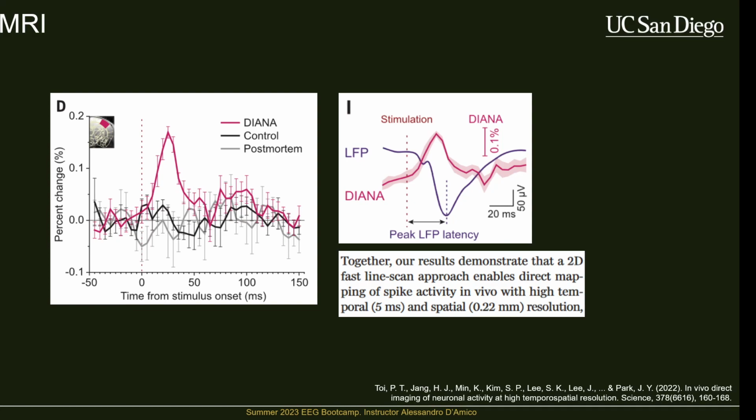We'll talk about it in this lecture, but if you move the eyes, because they're a charged dipole, you can pick up that electrical activity. Just like if you were to take something that reads electricity and spin a magnet, you can also see that activity change. The tongue is also a dipole, so if you have EEG on your head and you move your tongue up and down, you can also pick that up. Lots of things have dipoles or are dipoles.